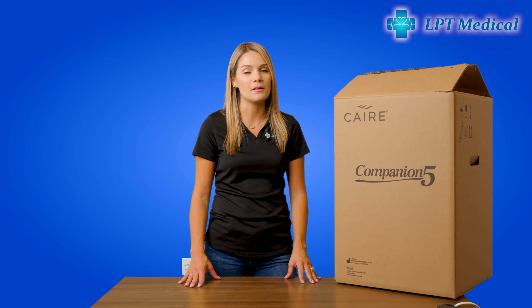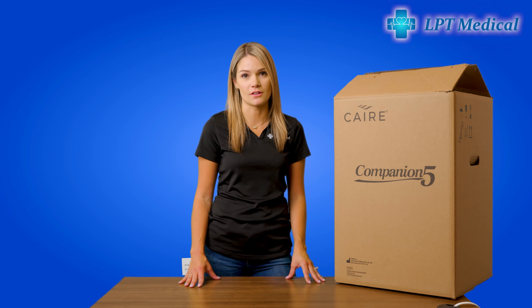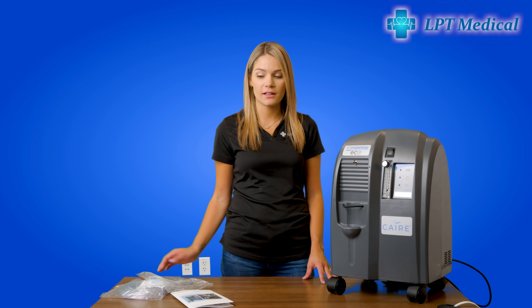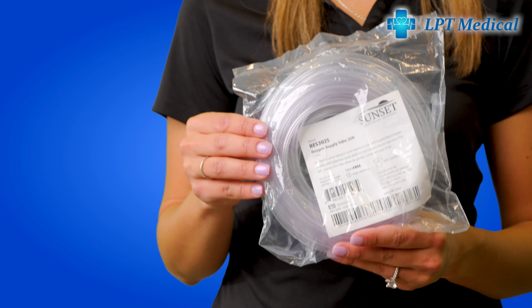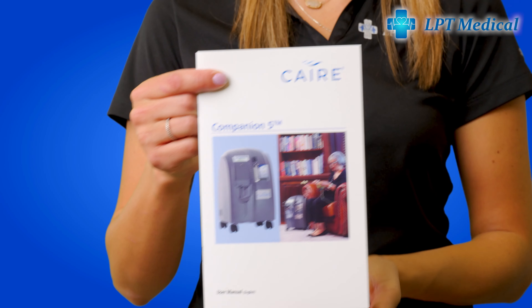Hi, my name is Alexia from LPT Medical, and today we're going to be doing an unboxing of the Care Companion 5 Home Oxygen Concentrator. In your package you will receive your cannula, you will also receive 25-foot tubing, and you will receive your user manual.